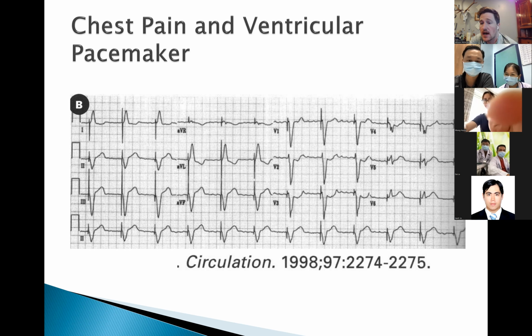So that just highlights the importance of trying to hunt down a prior EKG if you do have one, because it could help you make a decision. So if I saw this patient and I saw a prior EKG and they were having chest pain, I would alert our cardiology colleagues to hopefully be able to take this patient to cath lab very soon.